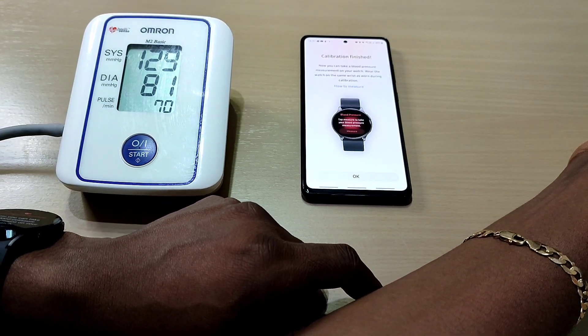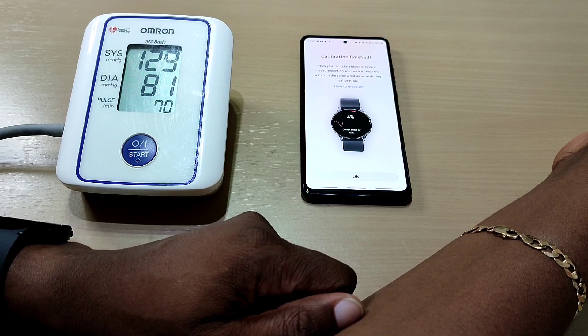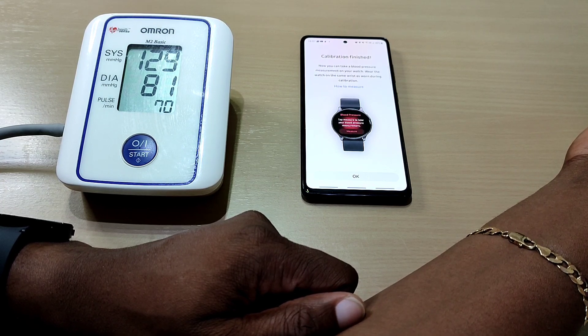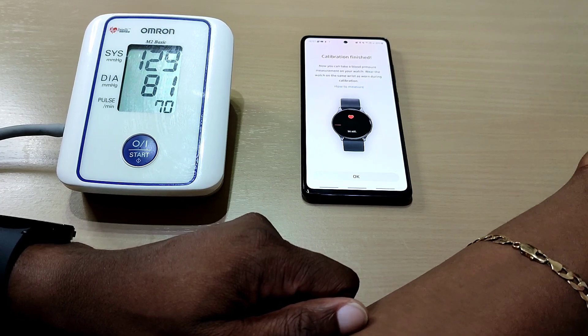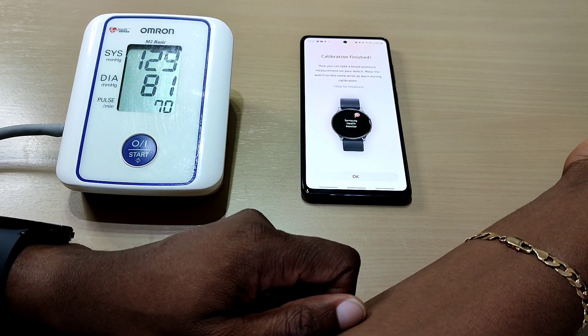It's important, guys — when taking the blood pressure reading, do not move or talk. In my previous video with the Watch 4 Classic, I was getting some high readings, even though I was staying still and had my hand elevated. So it's best to have your hand on a flat surface on the table. Stay still, stay quiet, take the reading and you should get a correct result.